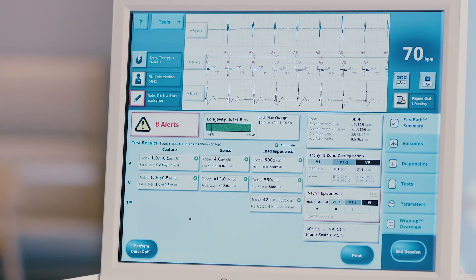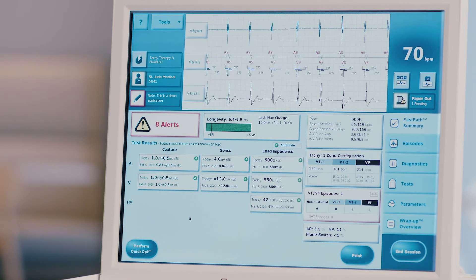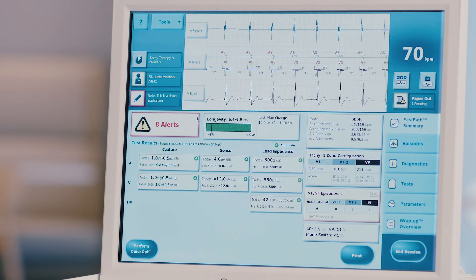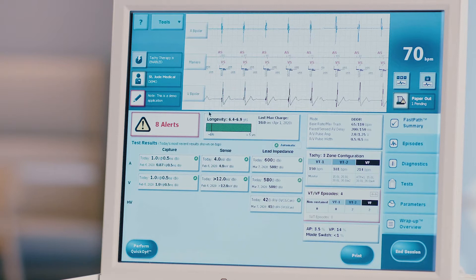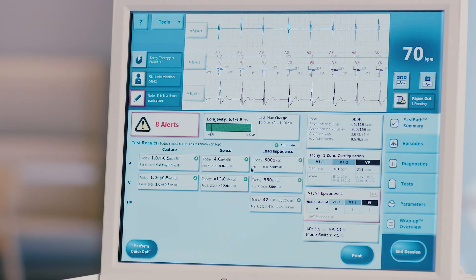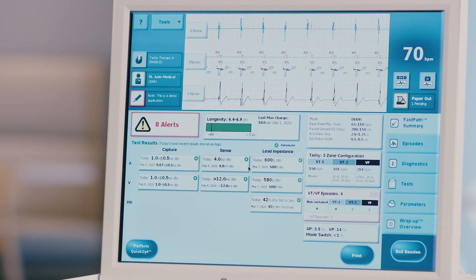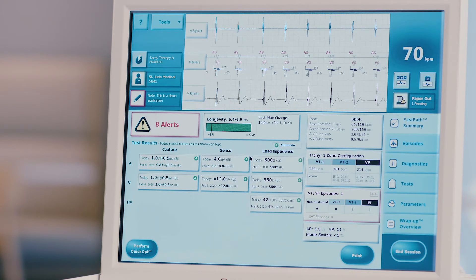Step 3: Review the FastPath Summary. This home screen will provide an overview of diagnostic information. Assess the patient's rhythm at the top of the screen in the live EGM display. Make note of the signals and markers present. Assess the battery voltage and longevity estimate, as well as the charge time and date of last full charge. Evaluate the automatic test results, denoted by the presence of a green A in the measurement box, measured by the device upon interrogation. Note that any box outlined in red either does not meet the safety margin or is outside the acceptable measurement range.